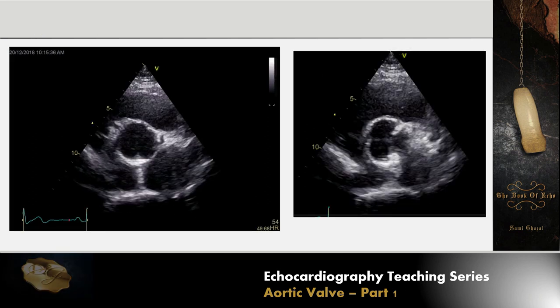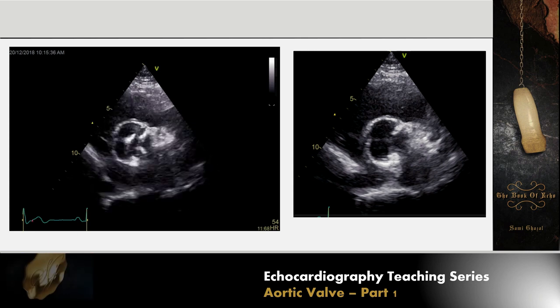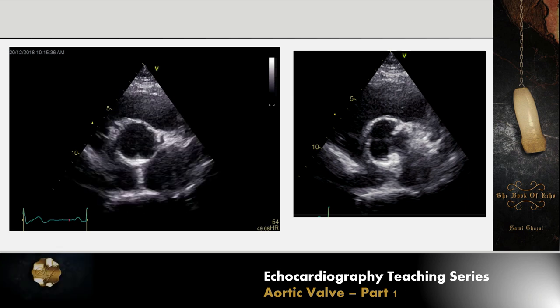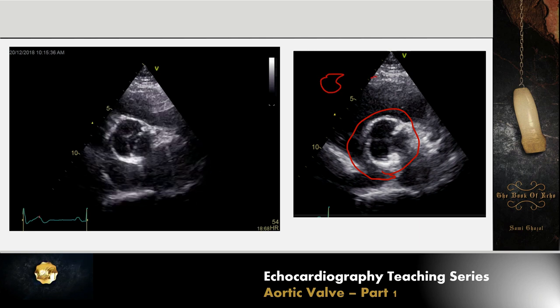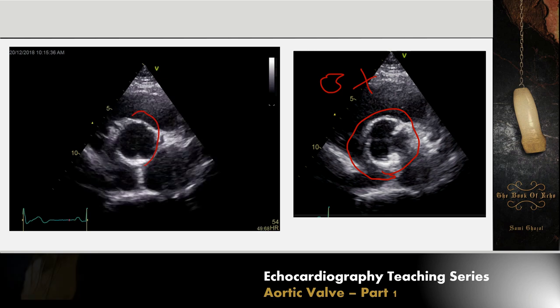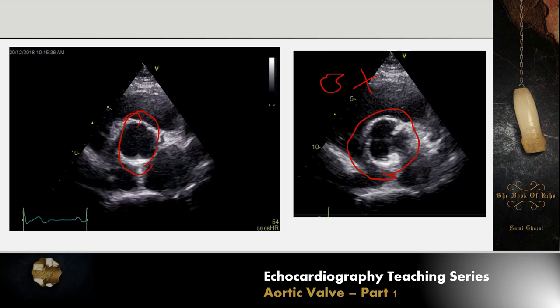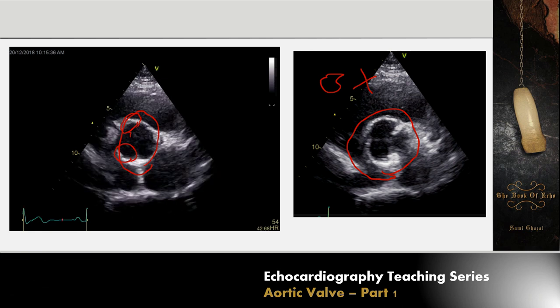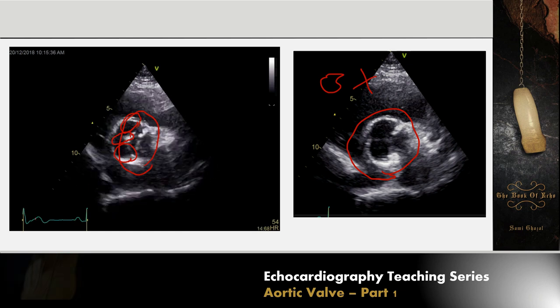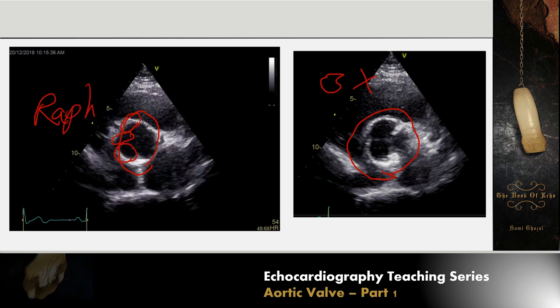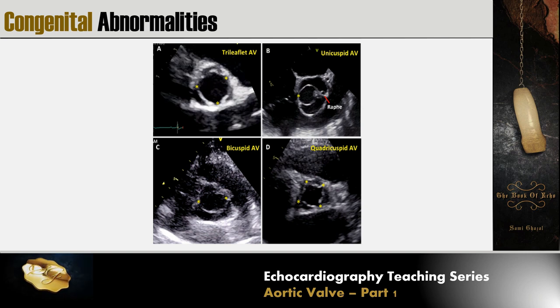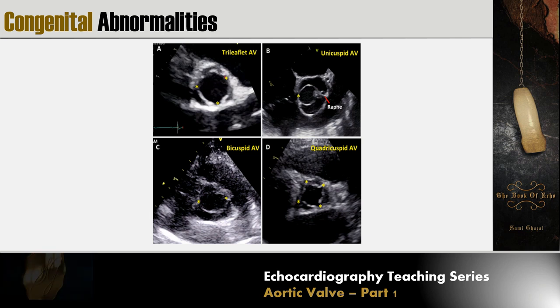In a bicuspid aortic valve, if you look at the valve in its closed position you will likely incorrectly identify it as tri-leaflet — this is why we assess only while the valve is open. You can see fusion between the right coronary cusp and the non-coronary cusp, and the line of fusion is sometimes visible and is called a raphe. In a tri-leaflet valve we count three fully opened commissures reaching the annulus; in a bicuspid valve, only two.